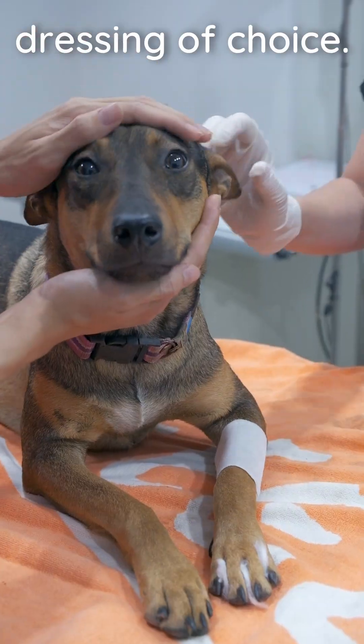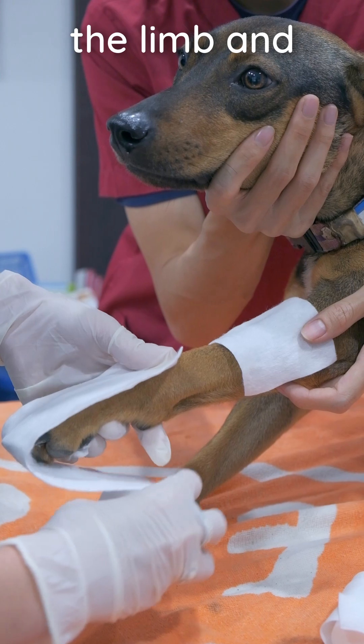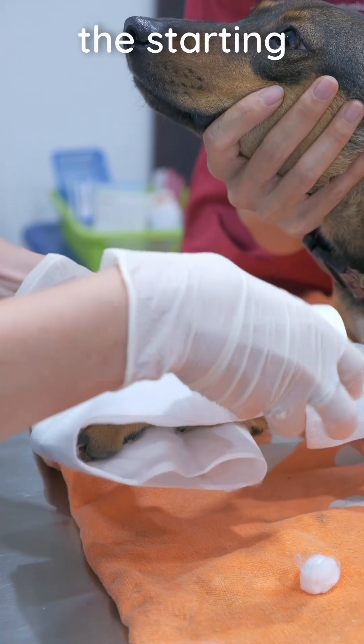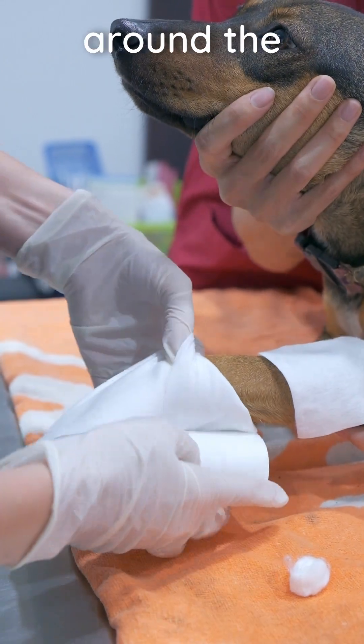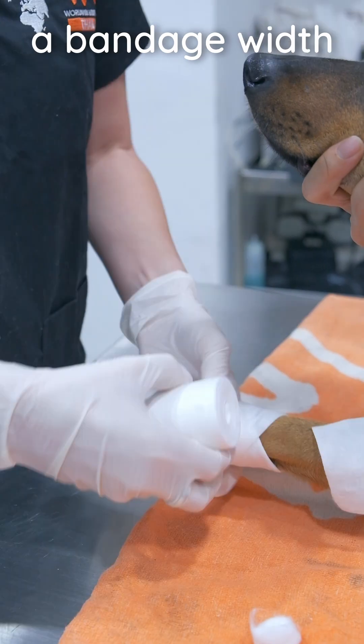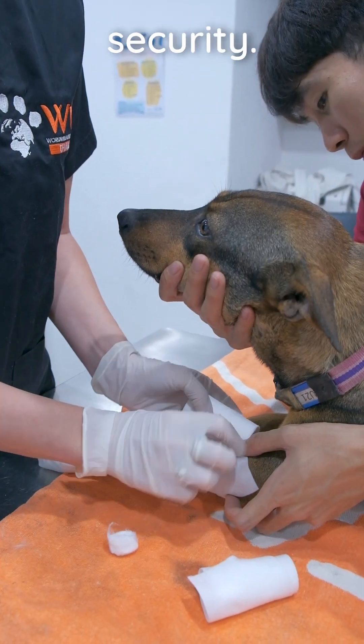Apply the dressing of choice, then with the roll on top, roll the soft bandage down the limb and over the paw. Go up to the middle of the limb and then reverse the procedure to return to the starting position. Then change the direction around the limb and move down towards the foot. Roll up from the end of the foot with half a bandage width of overlap. We're including the foot to prevent swelling and improve security.